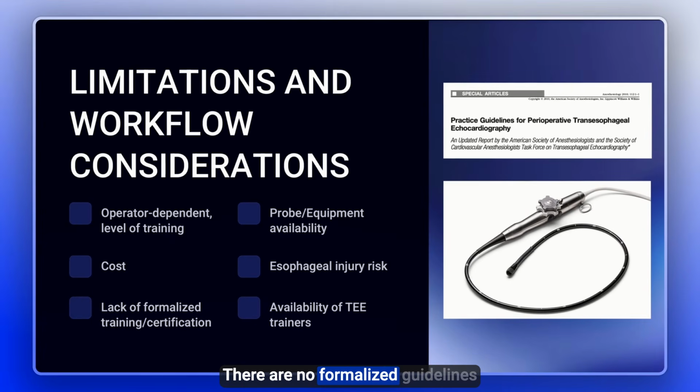There are no formalized guidelines or certifications for Rescue TEE, so keep that in mind, that we be wise about our utilization of it and really decide when it is of greatest clinical benefit to use this until some of these become more apparent. If you work exclusively in an emergency department and you're trying to have people teach you, it's not often you cross paths with experienced cardiologists or cardiac anesthesiologists that can teach you a lot of these techniques.